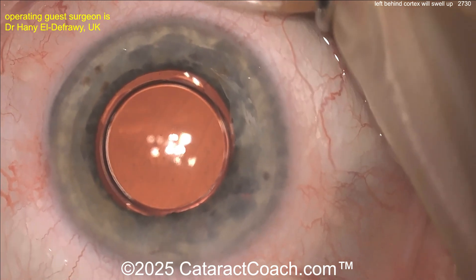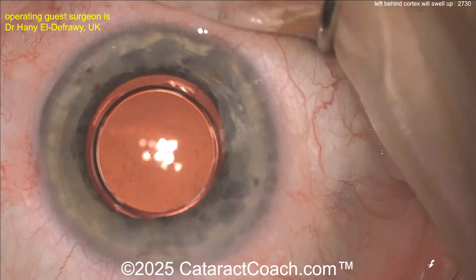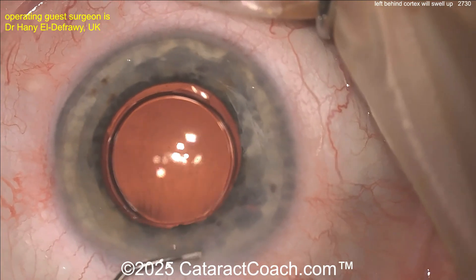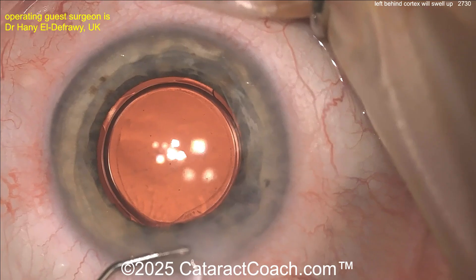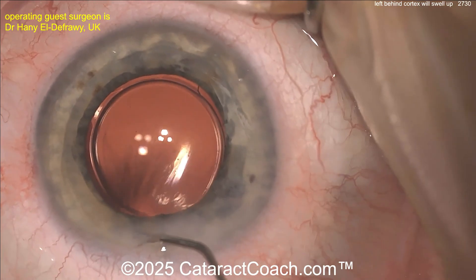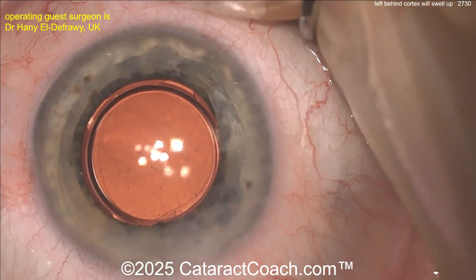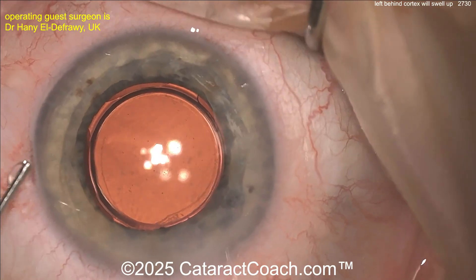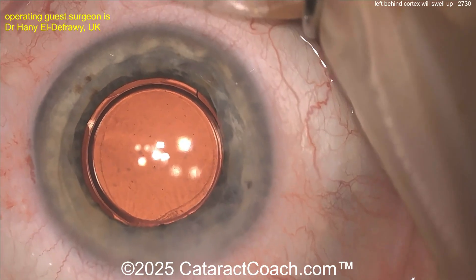I featured this video not because it's a difficult case, but to show you what you thought was just a little bit of lens material intraoperatively — when you see the patient the next day on post-op day one, it's swollen up significantly. That's what happens: a little bit of lens cortex left in the eye swells up to a lot. Even if you think it's in the lens bag equator and it's way out there — it swells up, releases from the bag, and moves right to the visual axis.